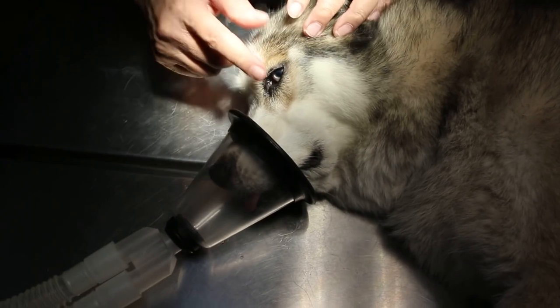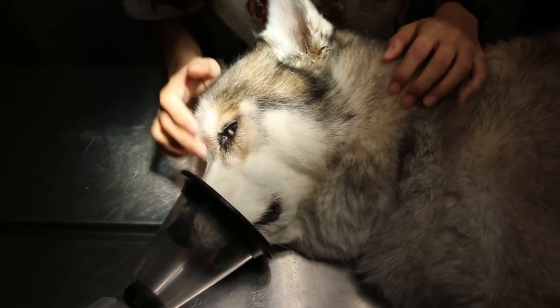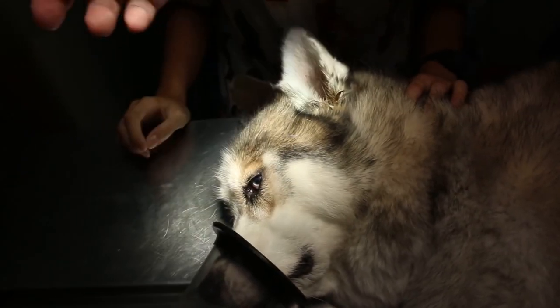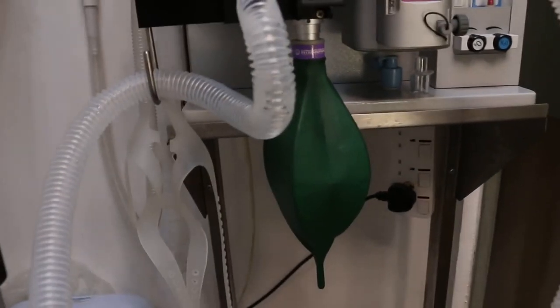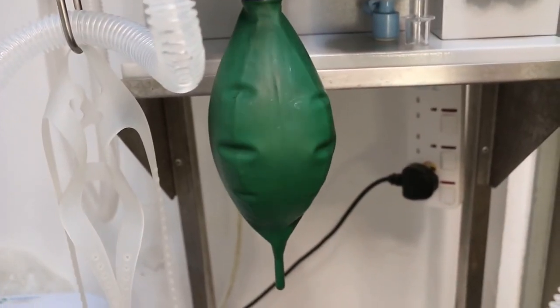We will put the cone in and check the blinking reflex. Once the blinking reflex is gone, I will do the ear irrigation. You can see the re-breathing bag — it's closed circuit — and the re-breathing bag is moving very well.